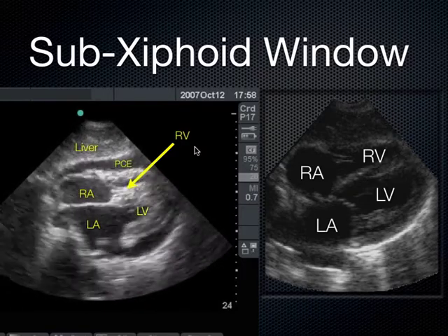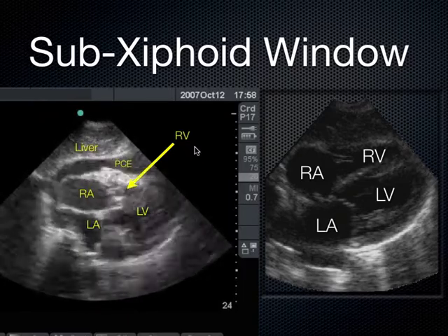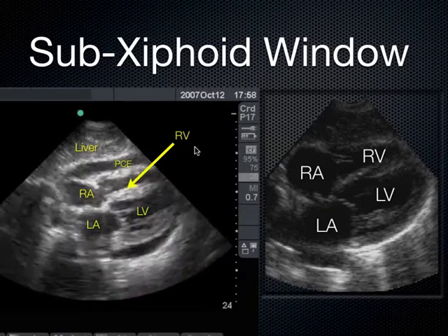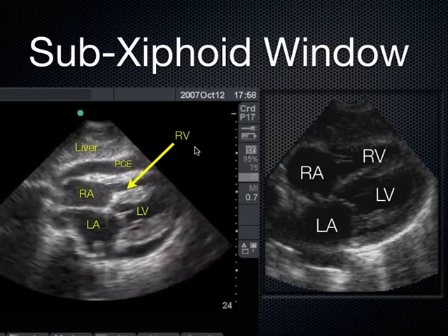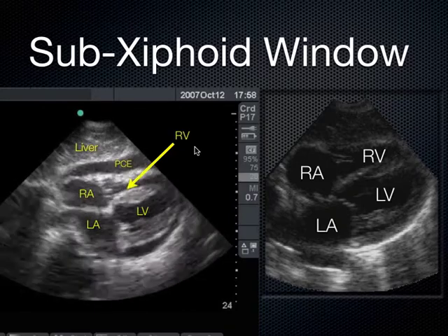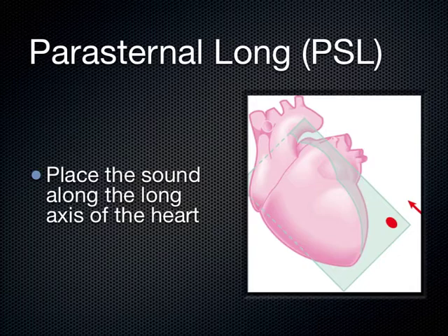And then also when I'm looking for any pericardial effusions, this is the first view that sort of comes to mind. And so, which is not surprising why in the FAST exam, there's two views of the heart. This view and the parasternal long, we always start with this view in the FAST exam because it is good for the pericardial effusions. Now, speaking of parasternal long, indicators aim to the patient's left hip or left elbow.